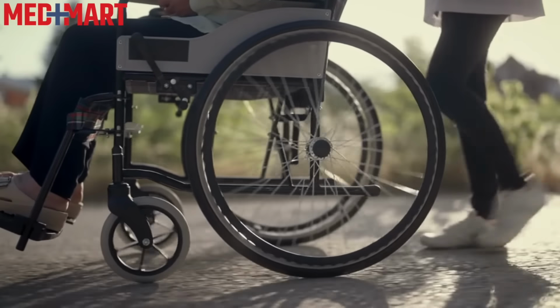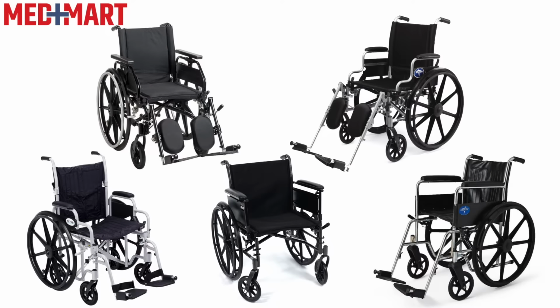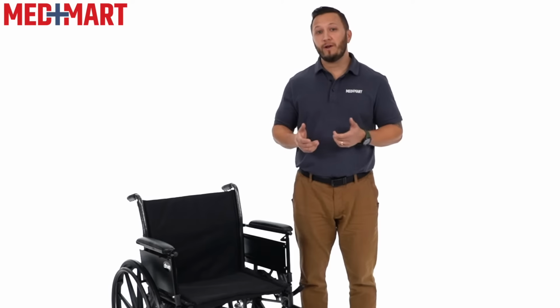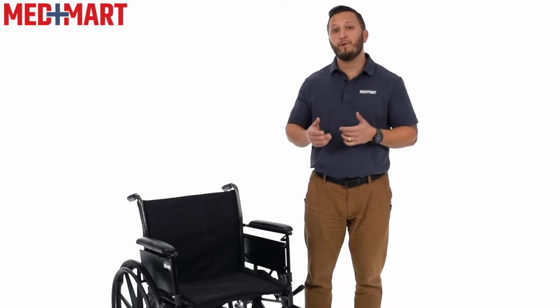Are you shopping for a wheelchair either for yourself or for a loved one, but you're not sure where to start? In this video, we'll go over the best options and things to consider when choosing the right wheelchair. My name is Kirk. I work as an assistive technology professional with Med Mart, and I've also worked as a physical therapist for over a decade.